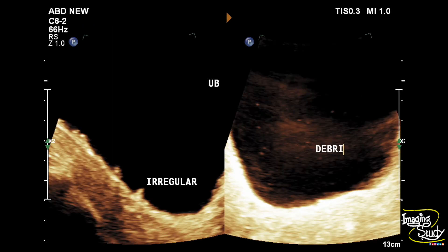We have magnified the image using the zoom option and you can see this irregularity looks like polypoid formations. On the right image with gain adjustment, you can see multiple tiny hyperechogenic foci indicating luminal debris. Now let's see this on real time.